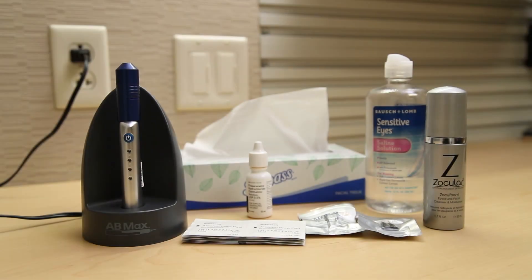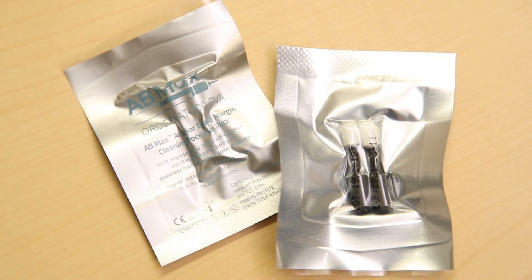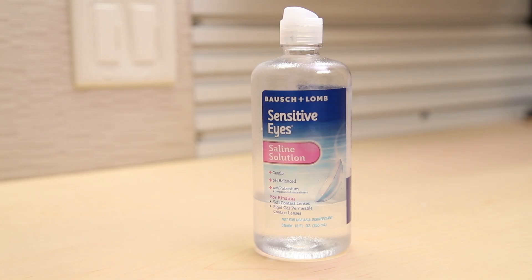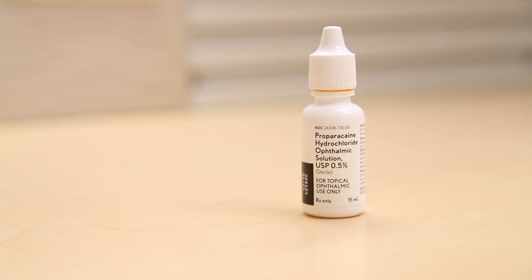Before starting, make sure you have all necessary supplies nearby. These include the AB Max unit fully charged, disposable sponge tips, alcohol wipes, eyelid foam cleanser of your choosing, sterile buffered saline for rinsing, tissues and/or paper towels, and anesthetic drops such as proparacaine or tetracaine.